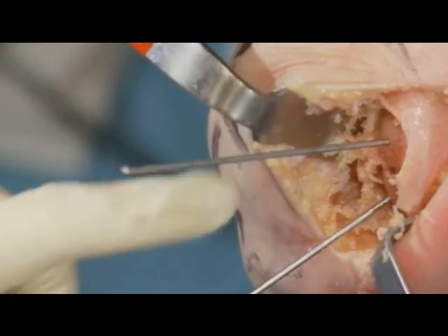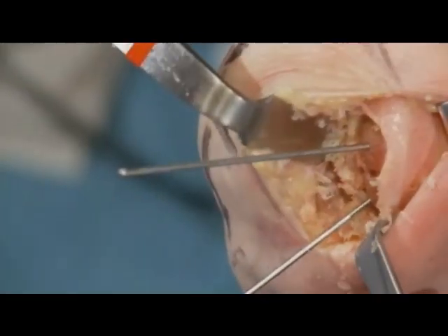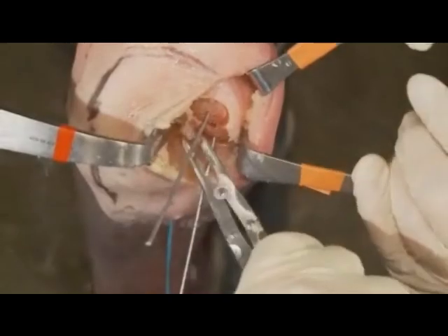So now we've taken that out. Can we just wash this out a little bit, get some fluid or something? So I'm just going to clean some of this debris.